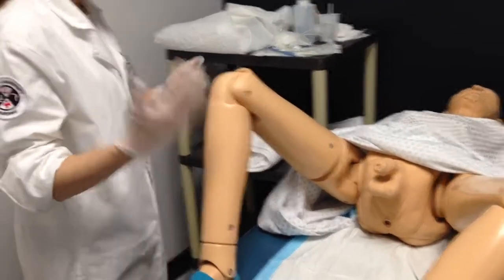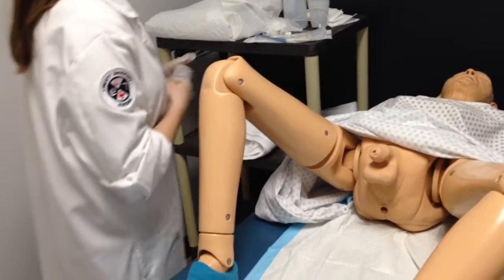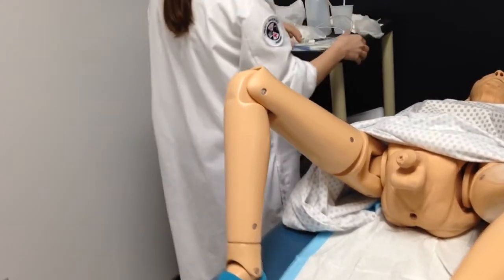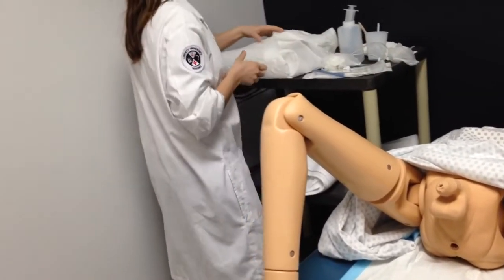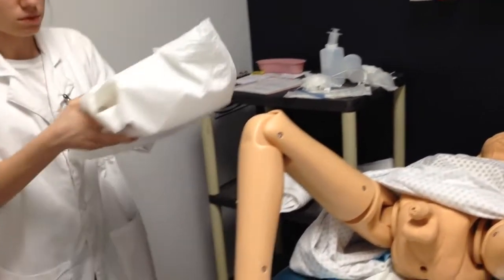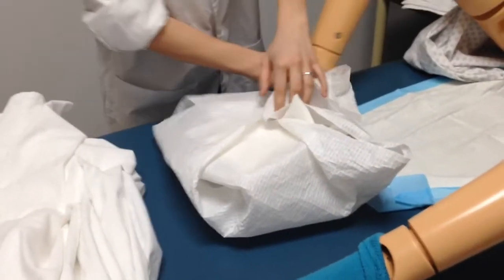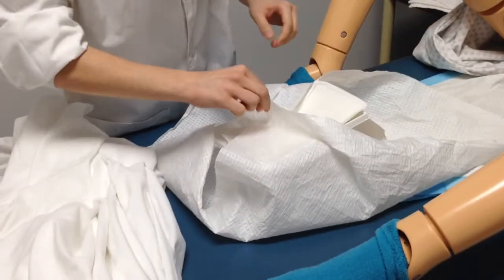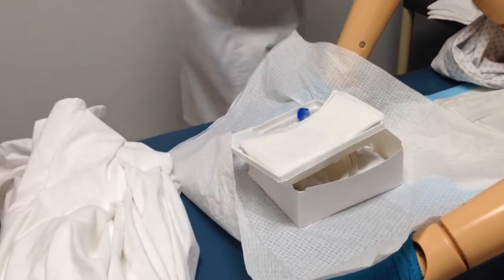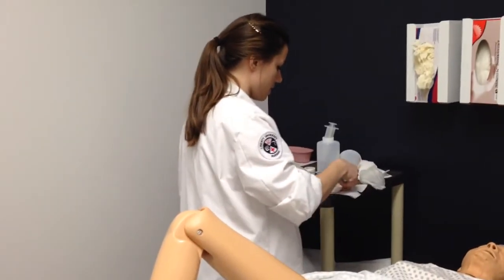Alright, so from here, after I'm done cleaning you, I'm going to remove my gloves and perform hand hygiene again. And we're going to go ahead and place the sterile field, using the 1-inch margin rule. Alright, and if it's okay with you, Mr. Jones, I'm going to use your chest to put on my gloves.